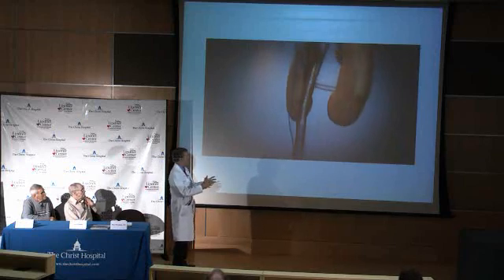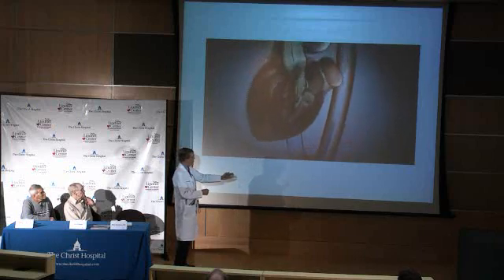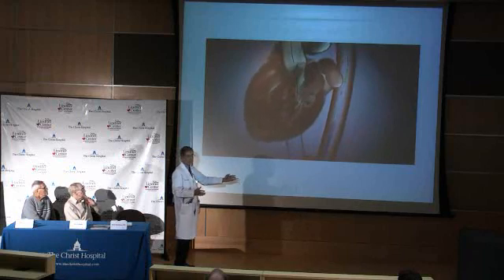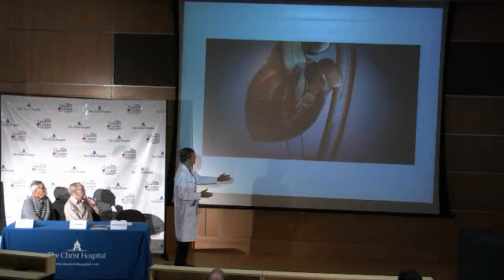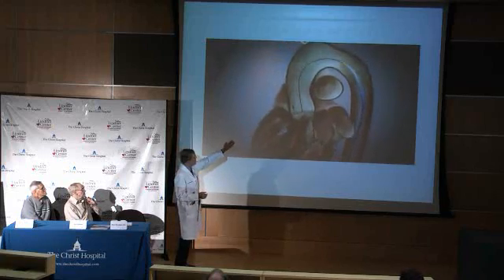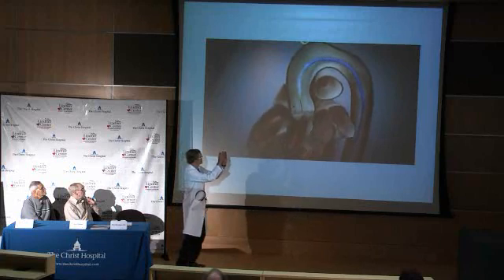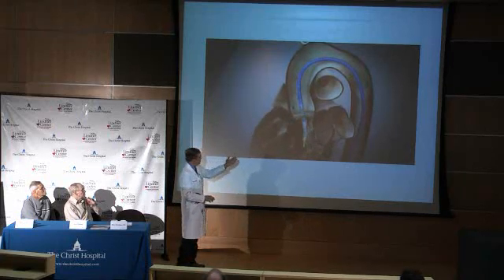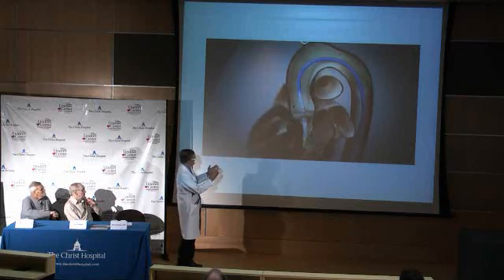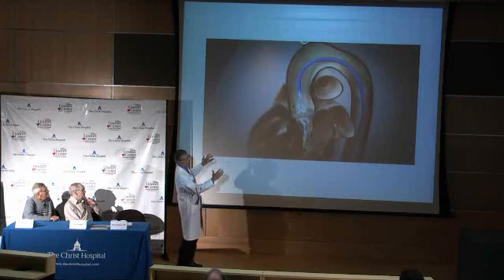So you want the heart to stand still while you do this. We then put a big sheath in — this is not for the faint of heart. These are large catheters; this is a serious procedure that has complications associated with it. We lock the stent, as you can see, and the valve is within the stent. Then we cross using the same wire left in place, pace the heart again at 180 beats per minute, and deploy. The minute the stent is expanded, the valve begins to work.